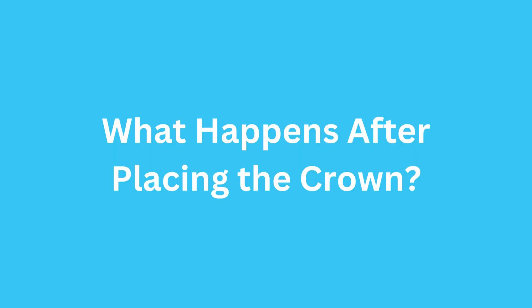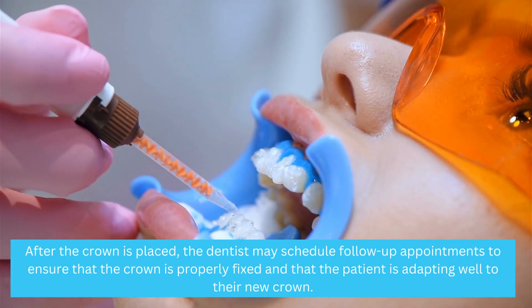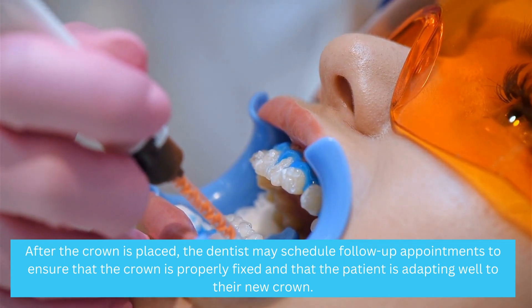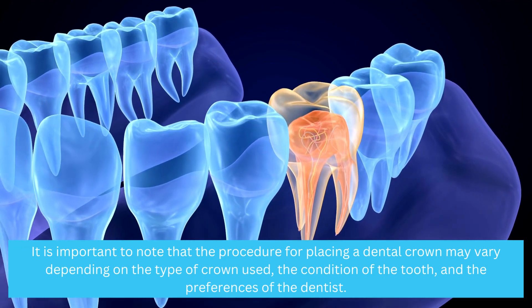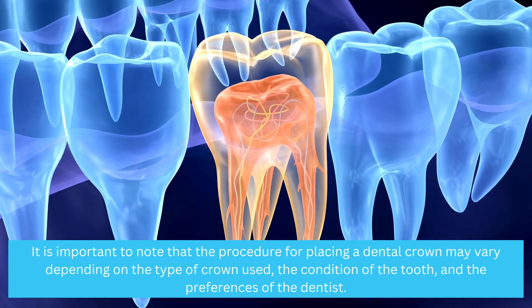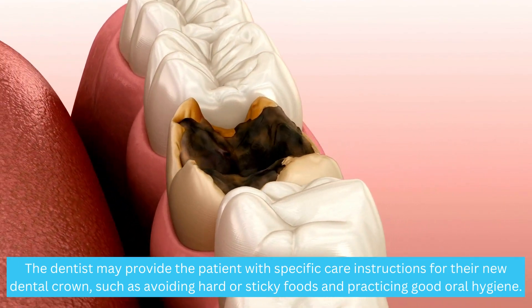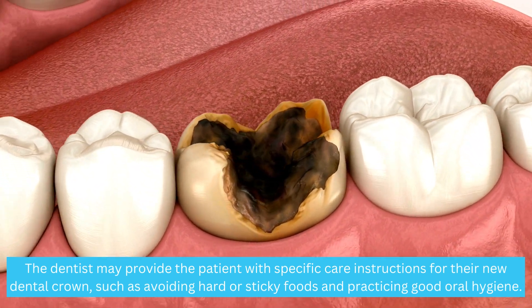After the crown is placed, the dentist may schedule follow-up appointments to ensure that the crown is properly fixed and that the patient is adapting well to their new crown. It is important to note that the procedure for placing a dental crown may vary depending on the type of crown used, the condition of the tooth, and the preferences of the dentist. The dentist may provide the patient with specific care instructions for their new dental crown, such as avoiding hard or sticky foods and practicing good oral hygiene.